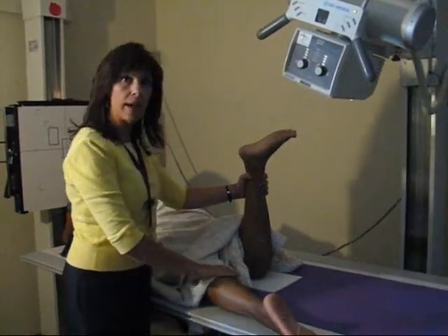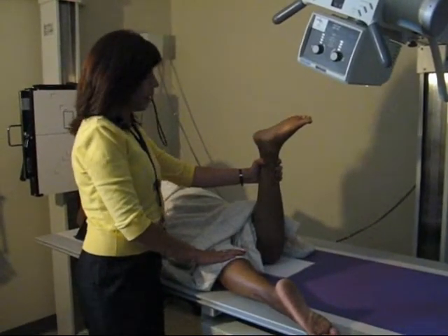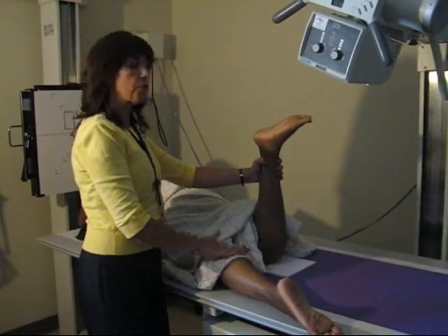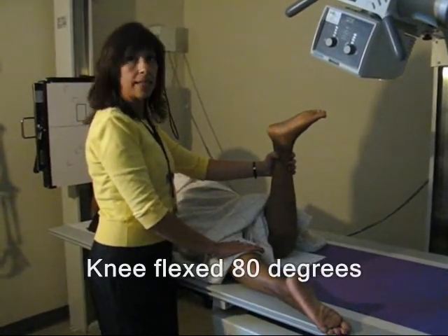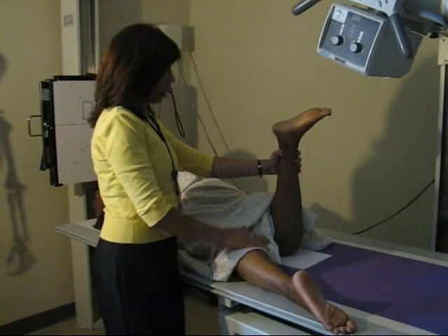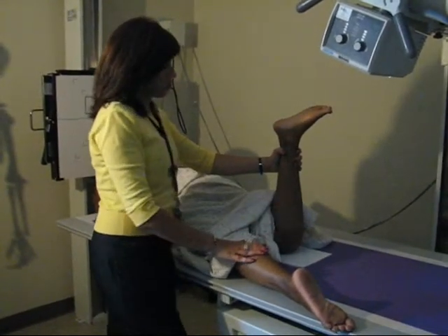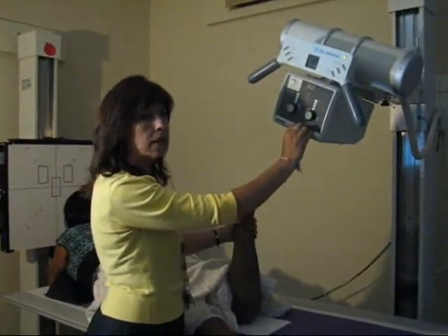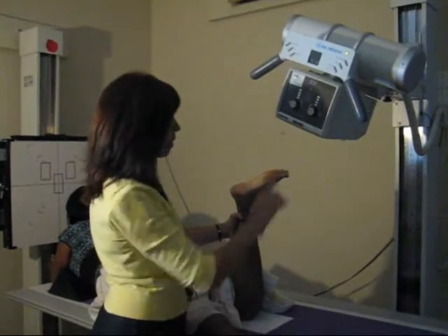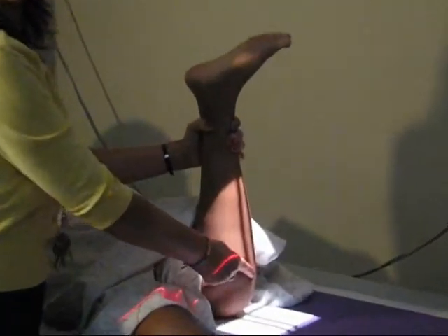So for the sunrise view of the knee, we're going to have the patient in a recumbent position, and we're going to have her flex her knee on the affected side about 80 degrees between the femur and the tibia, or the tib fib. We're going to angulate the CR about 15 to 20 degrees cephalad, and we're going to center the central ray in the inferior margin of the patella.